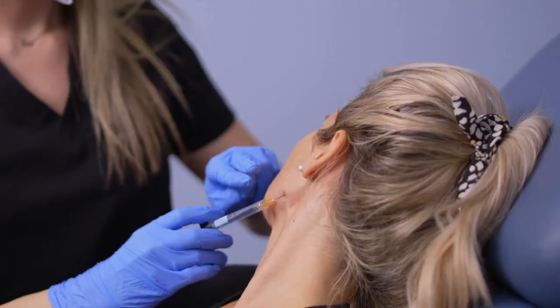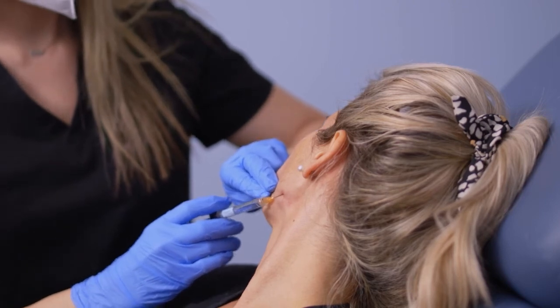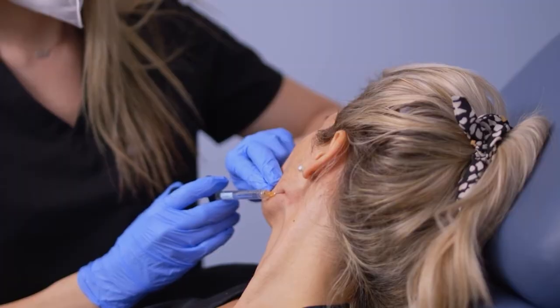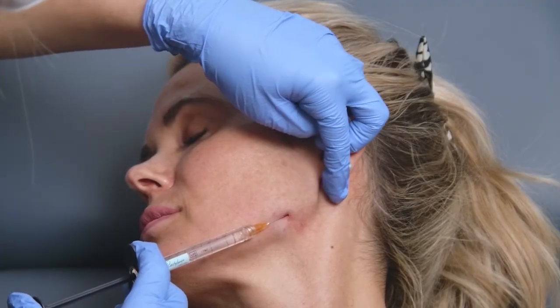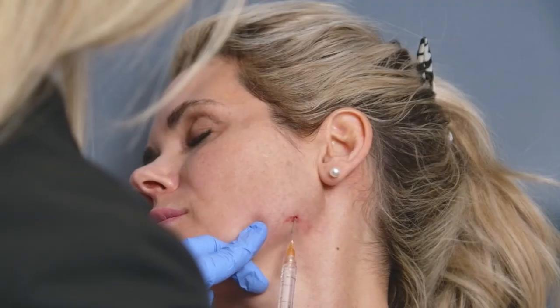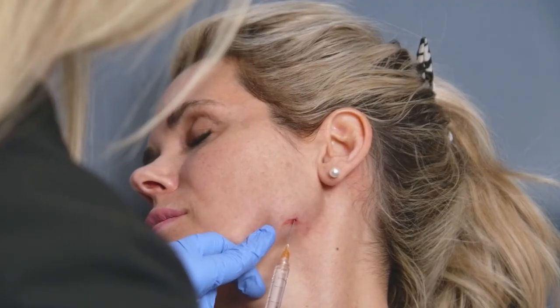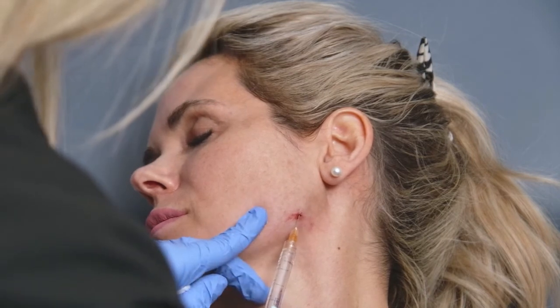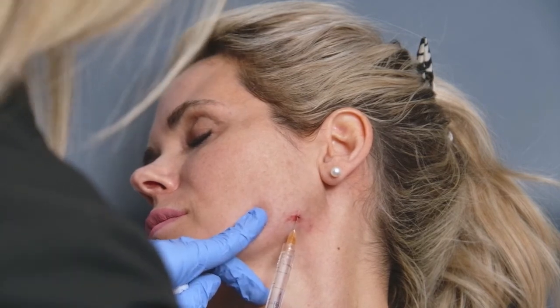So what I'm going to do is use a cannula and thread a little filler here more superficially. So now we have the cannula inserted. Now we're going to add some projection behind here. You can see where the cannula is here, and again, it has a blunt tip. This way I can go a little bit more superficially. And a lot of the time, the space in front of our ear can start to hollow and cause our jowling to look worse.